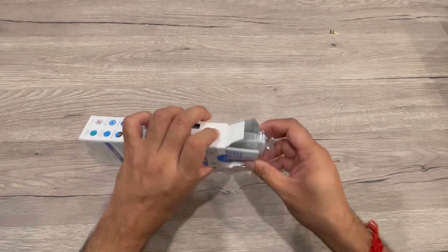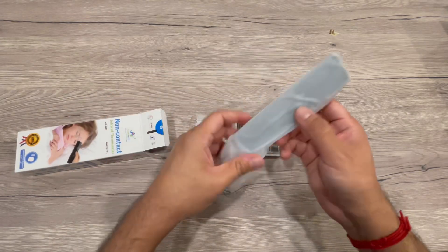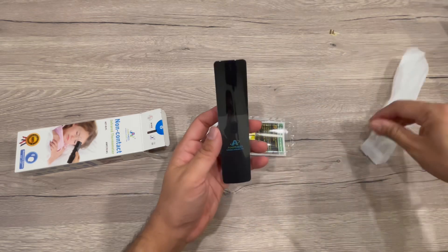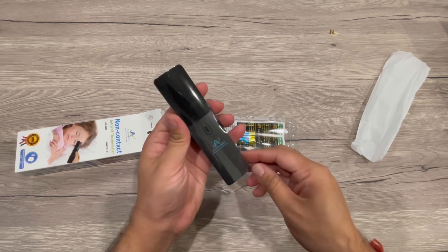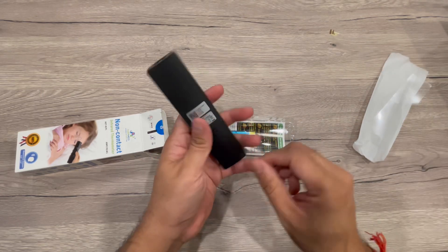It's an infrared thermometer — you bring it near your head and push a button, then the thermometer's infrared rays will pulse and get the temperature from it.